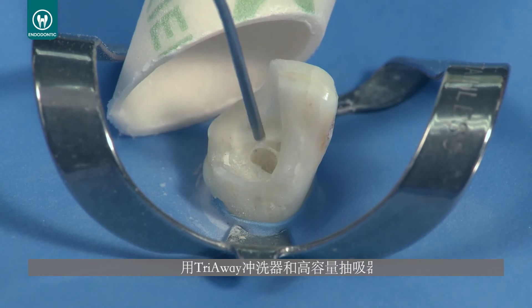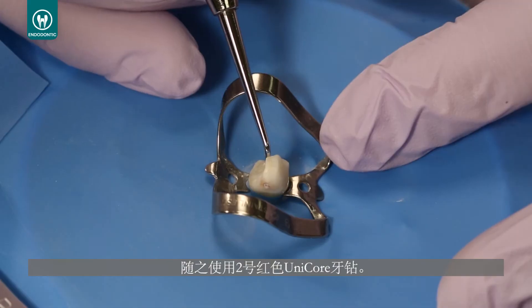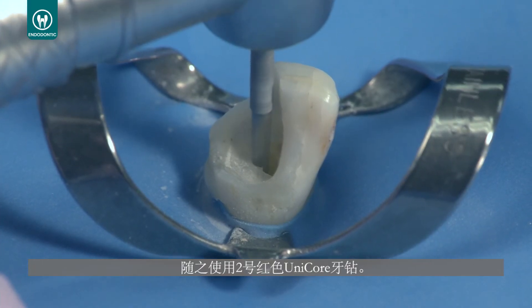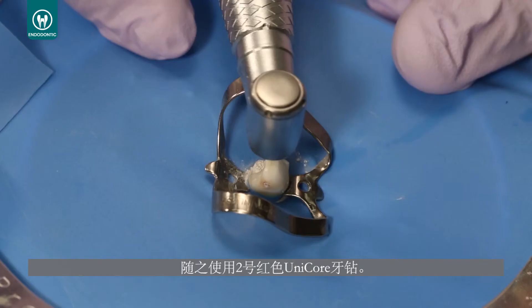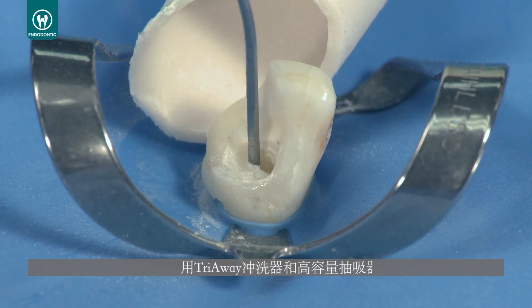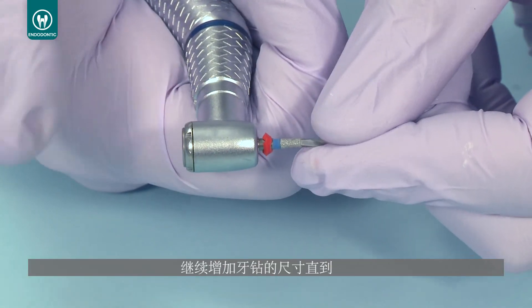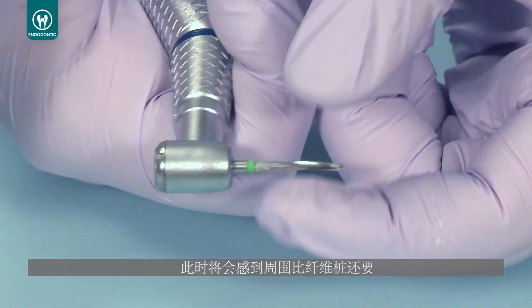Remove any debris with the try-away adapter and high volume suction, then recheck your post space depth. Follow with the number two red Unicore drill. Continue increasing the drill size until you reach the point where the drill is surrounded by cement and dentin, which will feel softer than the post.